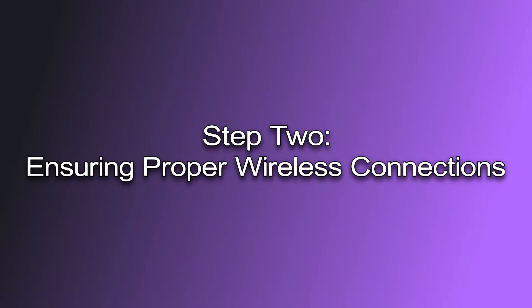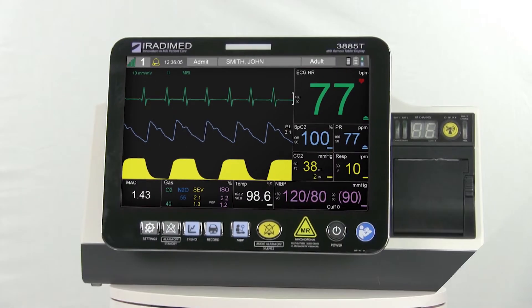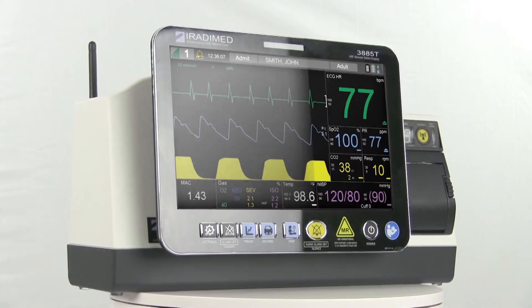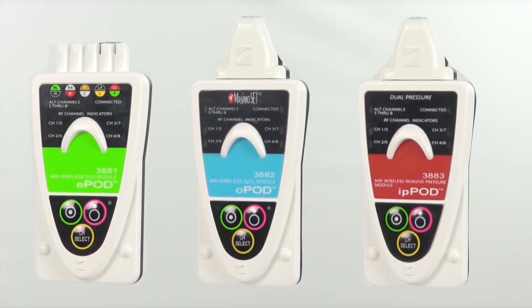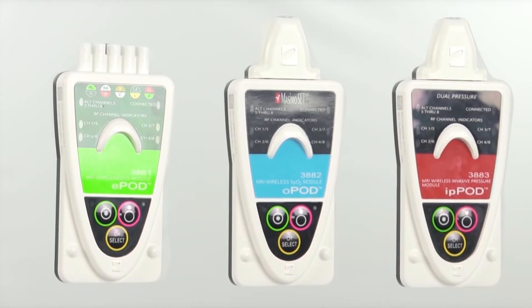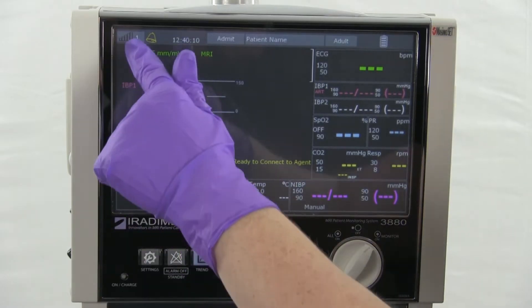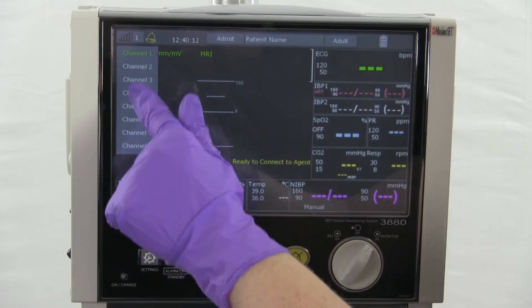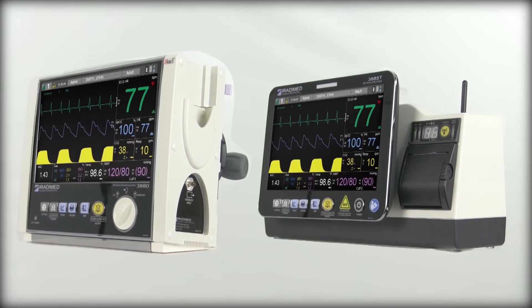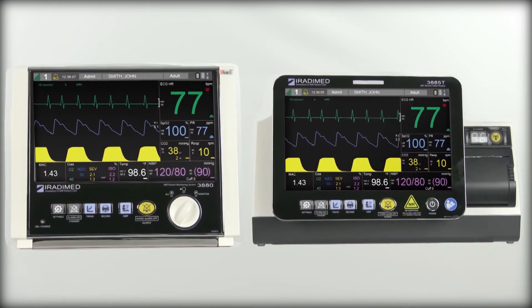Step 2: Ensuring proper wireless connections. The next step into setting up the 3880 monitor system and remote is to ensure that all devices are connected on the same wireless channel. There are eight unique wireless channels for the 3880 system to utilize. Ensure the 3880 is on a unique wireless channel that is not being used by any other nearby systems. To select the appropriate channel on the 3880 monitor, the user will gently press the signal indicator. A drop-down menu showing channels one through eight will appear on screen. The user will then click the desired channel if it needs to be changed. Make a mental note of the channel selected, as this will be used to synchronize the other 3880 components.